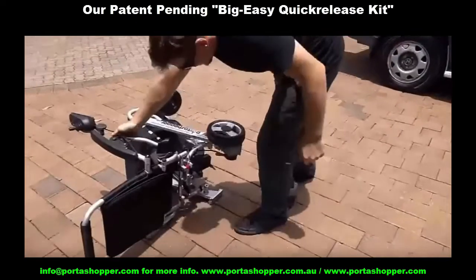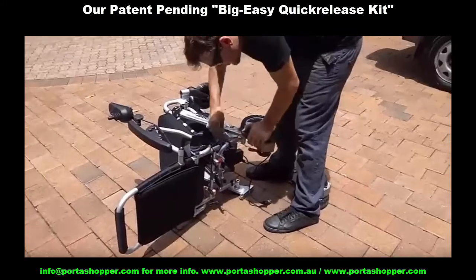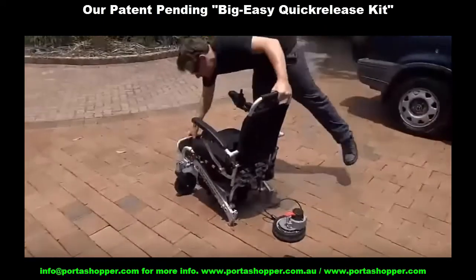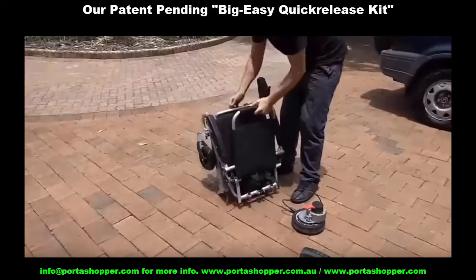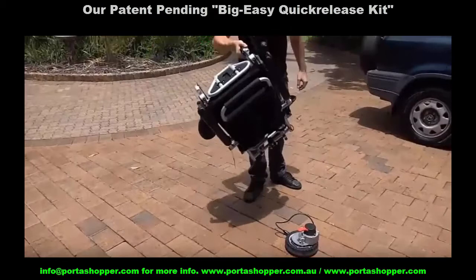So if it's hard for you to lift between 20 and 30 kilograms, have you found a lightweight folding model that simply detaches into three easy-to-lift parts so the heaviest part weighs only 12 kilograms or about 25 pounds? And are you aware of what a huge difference it makes?